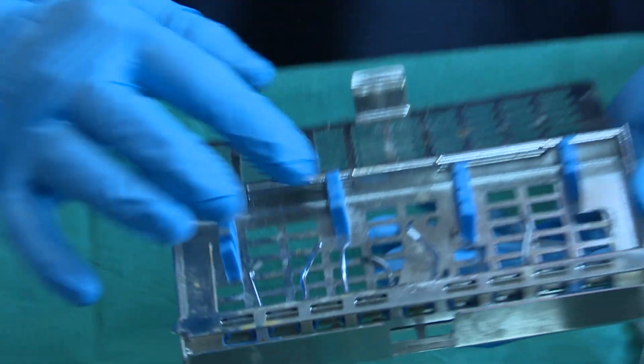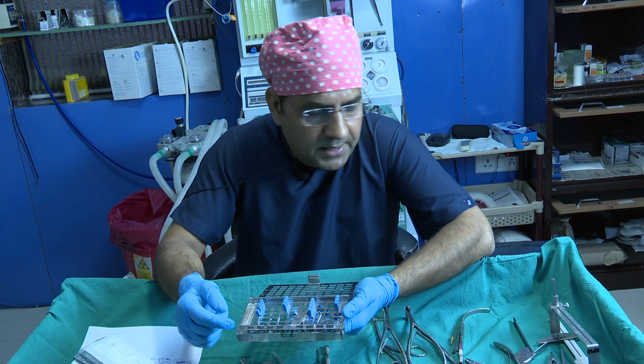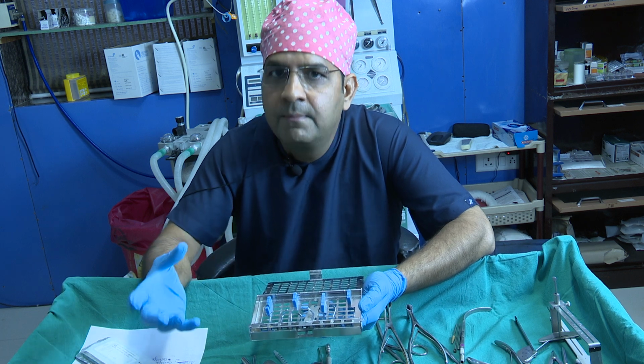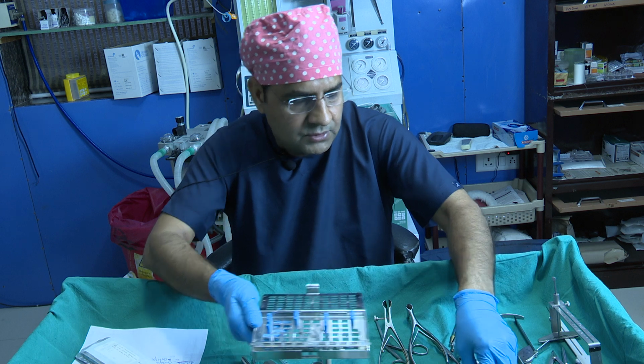So we use these different types of tips. The problem with the Piezo is that it takes a lot of time. So in the Indian scenario, where we already have too much bump, I think the burr is the good instrument.